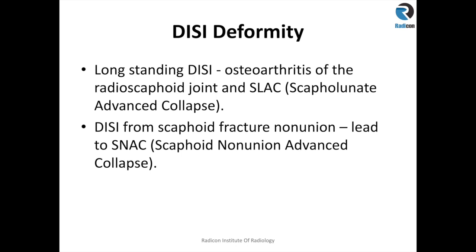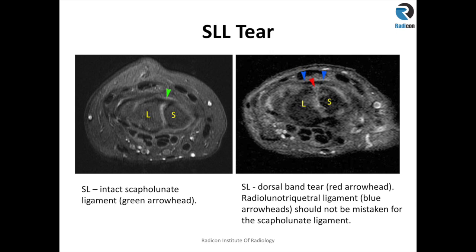Here is an example of a tear of the dorsal band. The green arrowhead indicates the intact dorsal band of the scapholunate ligament. On the second image on the right, the dorsal band cannot be clearly identified and there is intermediate signal present, which indicates a dorsal band tear of the scapholunate ligament.